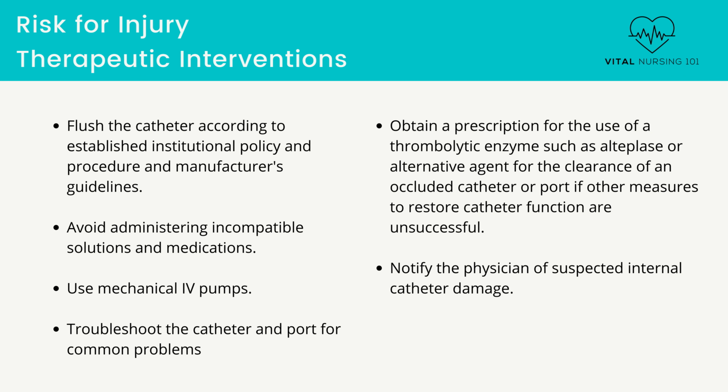Infusion of incompatible solutions may cause precipitation within the catheter and eventual obstruction. The nurse consults drug and solution compatibility charts before administration. The nurse can consult with the pharmacist if the charts do not provide sufficiently clear compatibility information.